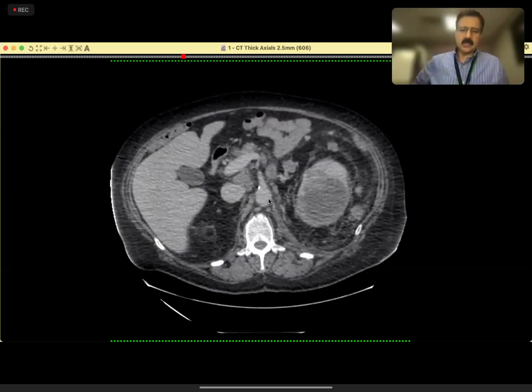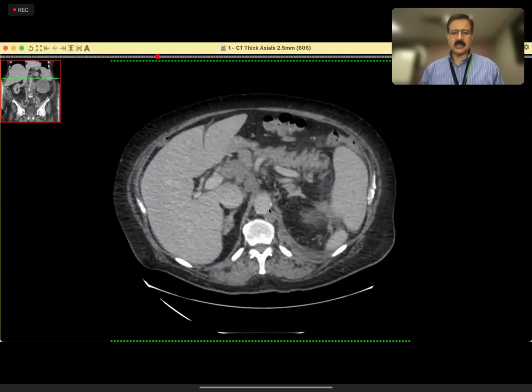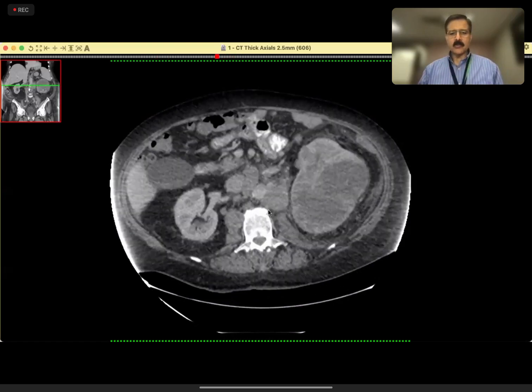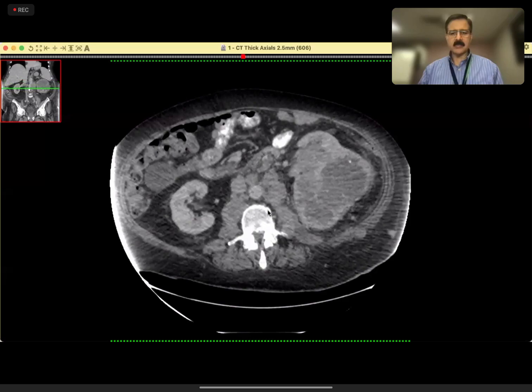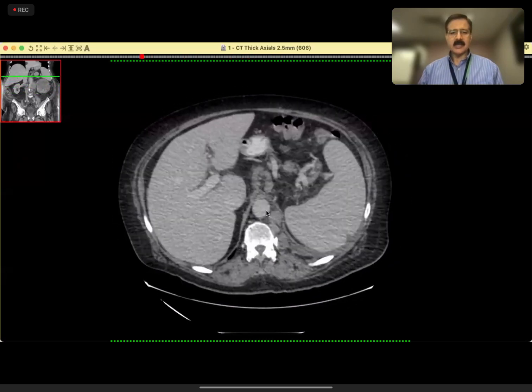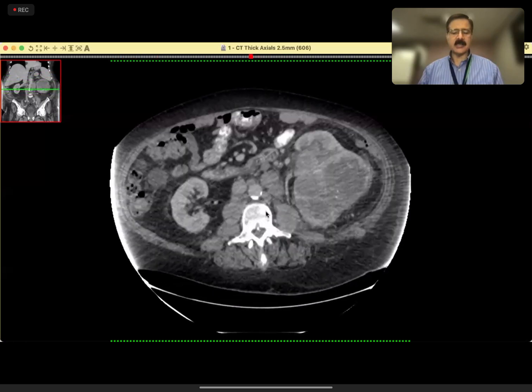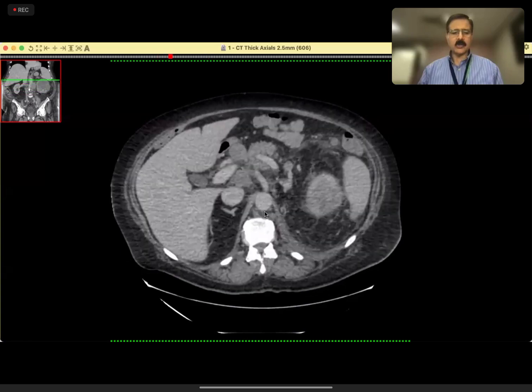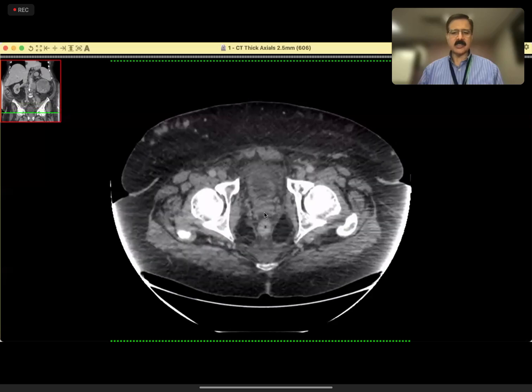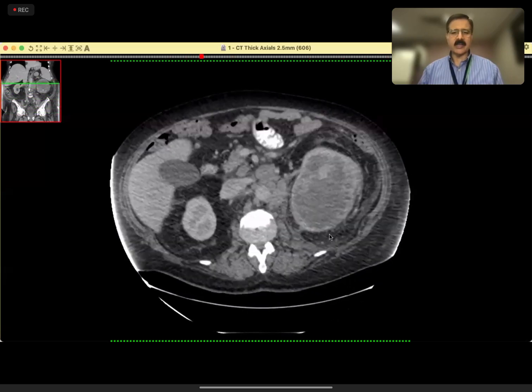This particular case I am showing you is a classical case, actually not for a VIVA, but for a long case. There are many types of cases which come in long cases, and one type is, as I am showing you, where the case is simple but the findings are multiple. Everybody is going to pick up that this is an RCC, and most of you are going to pick up that this RCC has bony metastasis. But look for everything very carefully.